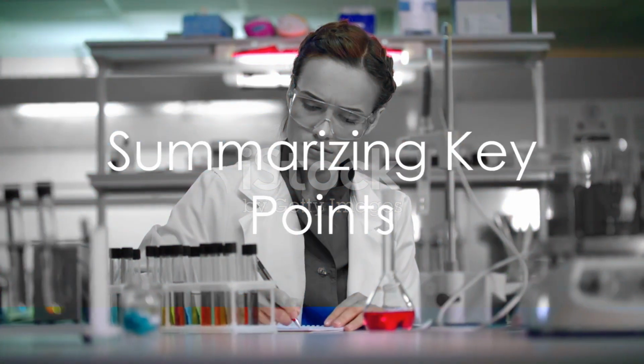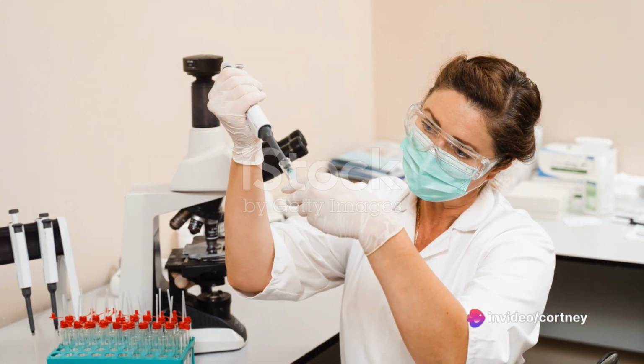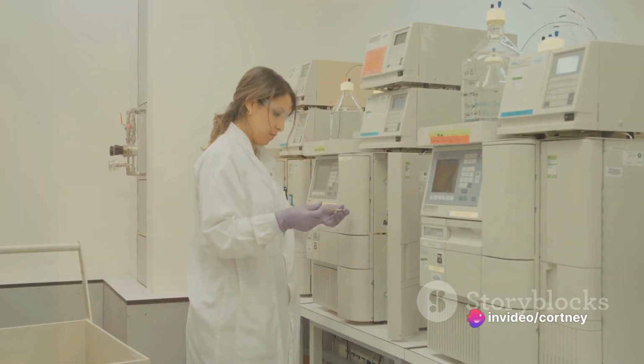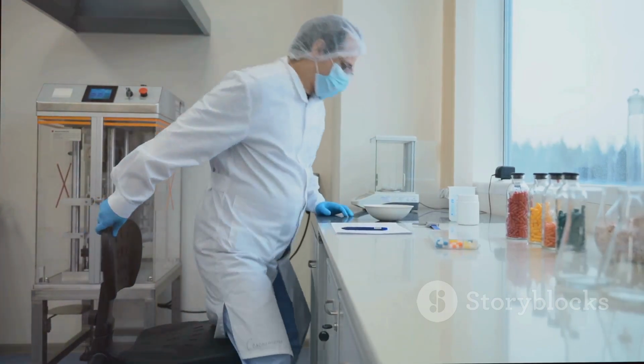So, how does a drug test unfold? It's a two-step process. First, the preliminary immunoassay test screens for potential positives. Then, gas chromatography steps in, pinpointing the exact drug or its metabolite. Remember, the goal of drug testing is to ensure safety and fairness, whether it's in the workplace, sports, or other areas of life.